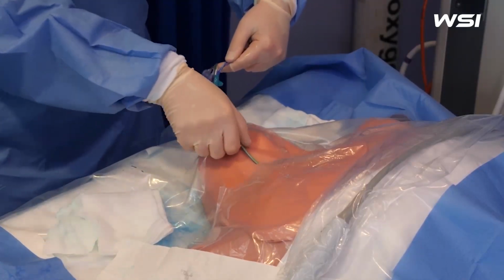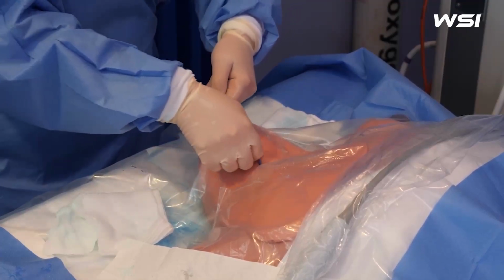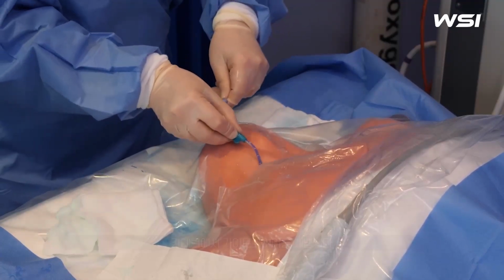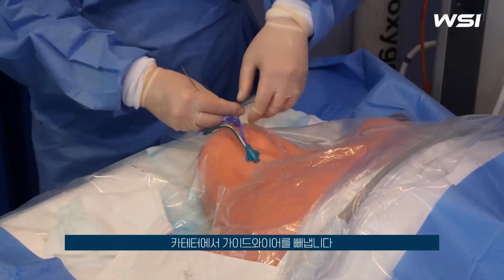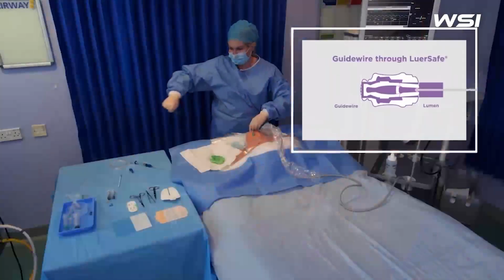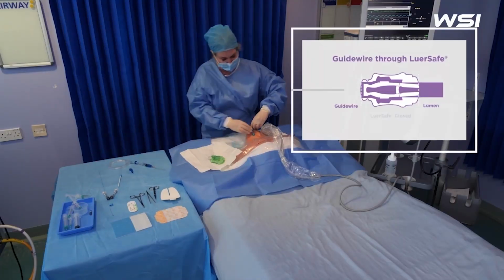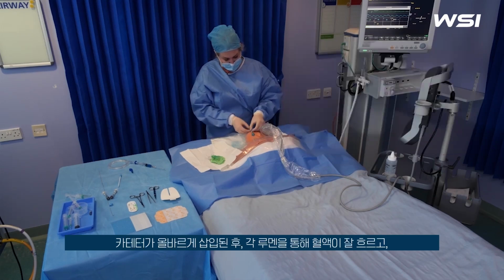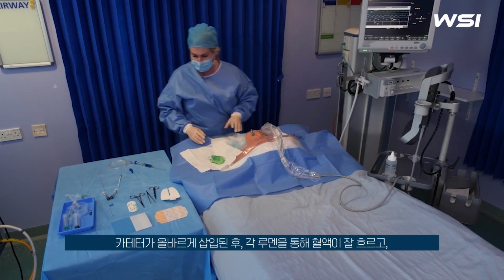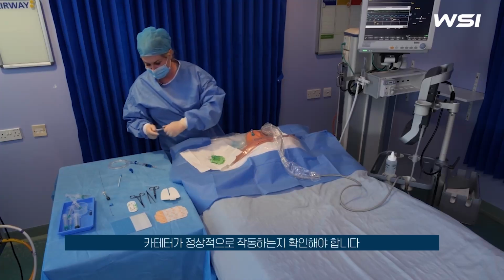Go to your predetermined length. This is a very, very long torso, so I'm going to go into 20 centimetres. So you can use the modified Peres equation if you're wondering how far to go, and that will give you a good estimate of how deep your catheter should be, left or right. So what we've got to do now is confirm, 1, that we're in a vein, and 2, that all of the lumens are in the vein.